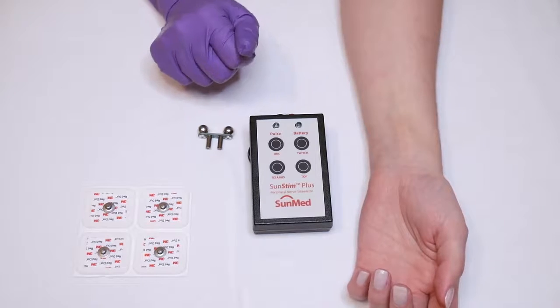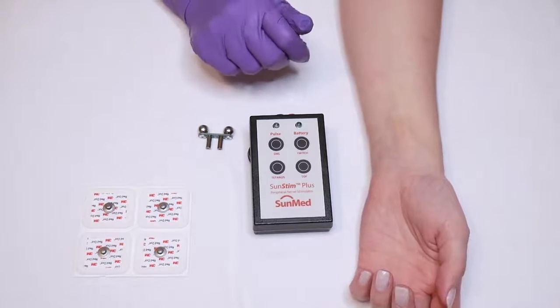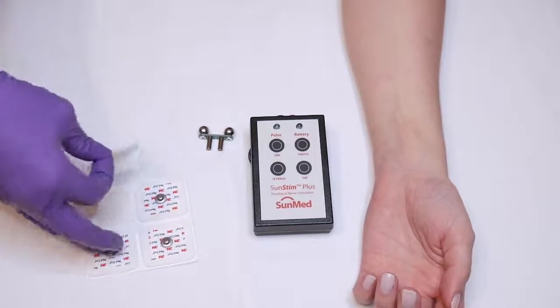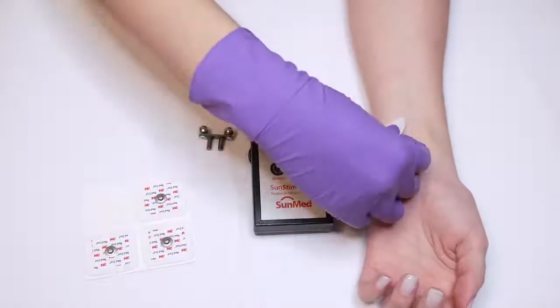For correct electrode placement, you will attach one electrode along the path of the ulnar nerve, and the second about two centimeters away, preferably not in the path of the ulnar nerve.